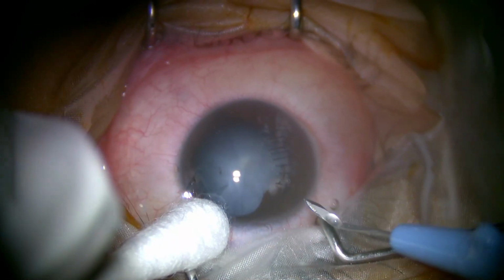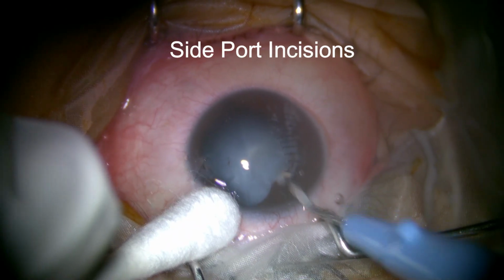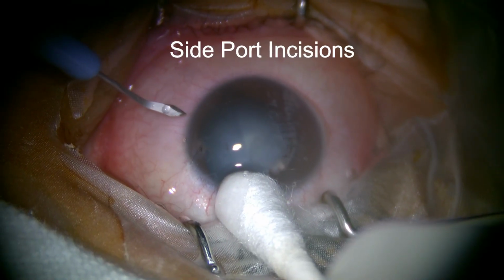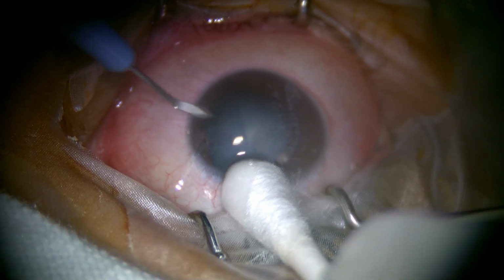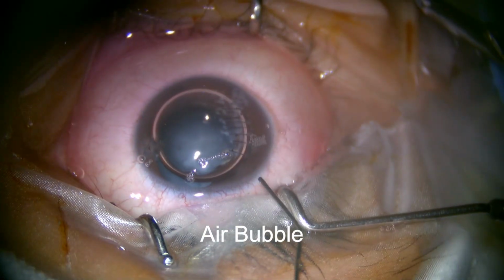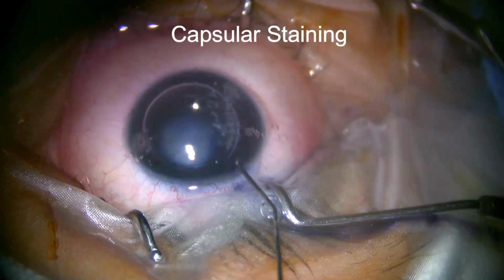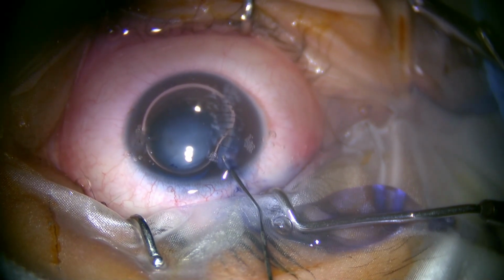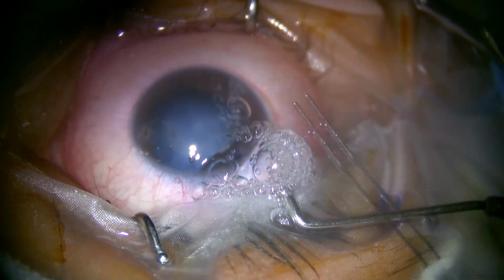For this, firstly the side port was created at 11 o'clock position and then at 4 o'clock position using MVR blade. After that, air is injected and anterior capsule is stained by trypan blue dye followed by anterior chamber wash and injection of viscoelastic substance to form anterior chamber.